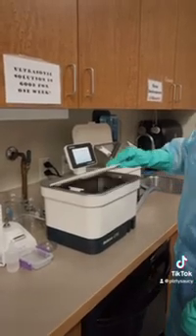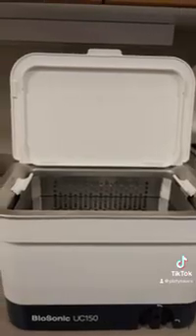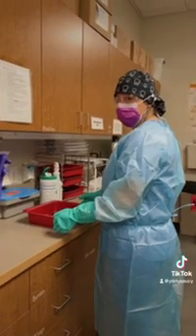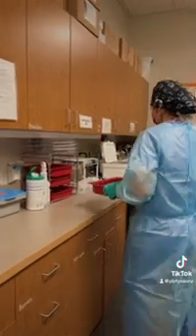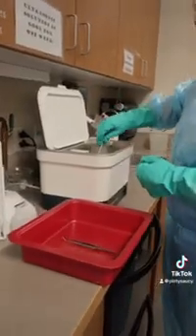Next we're going to remove the lid from the container of the ultrasonic device. We're going to determine that the ultrasonic device is filled to the point recommended by the manufacturer. We're going to place our loose instruments into the basket.